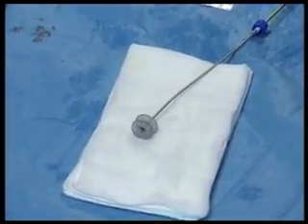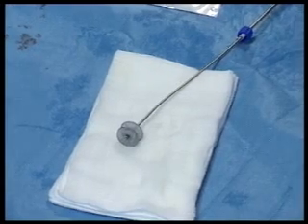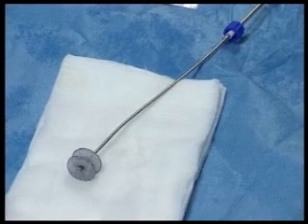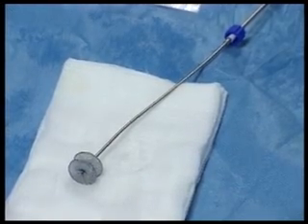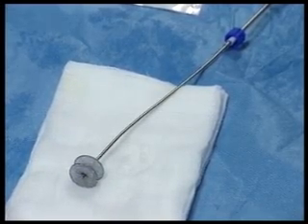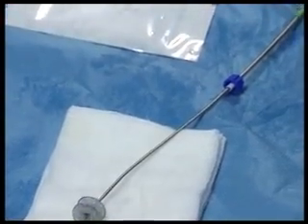But I think you can use both, and we had this debate earlier whether we should just use the one that came with it rather than open a cable from an ASD, and we opted to open a cable from the ASD. But I'd be happy, and we've certainly put them in, just using the pusher and the other wire. I don't think they're any particularly less stiff, but if you see it pulling the whole sheath out of the ventricle, then you're right. Well, in our experience, we prefer to use the thinner one. Okay.